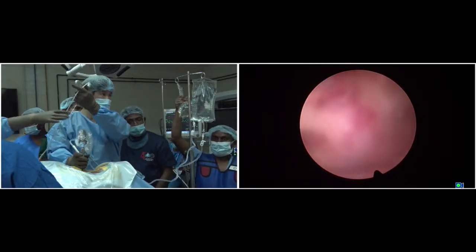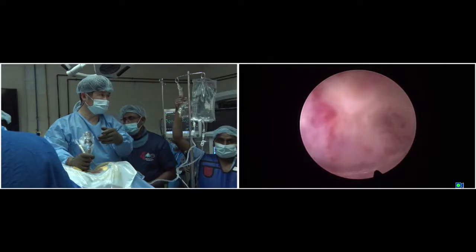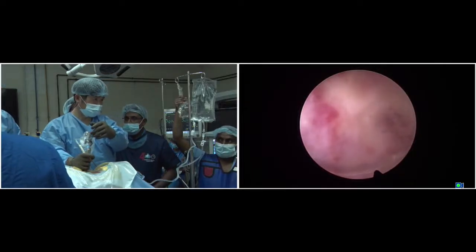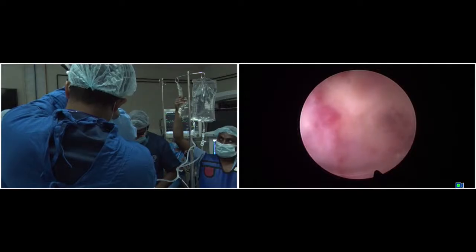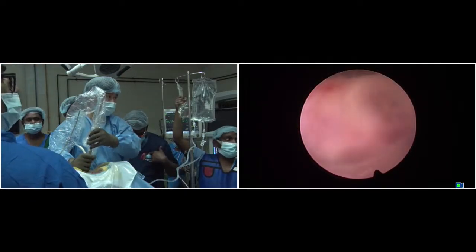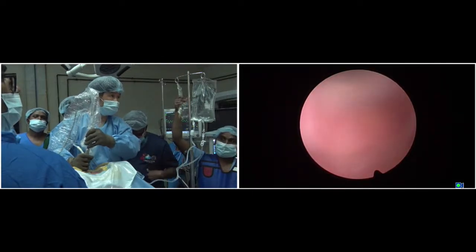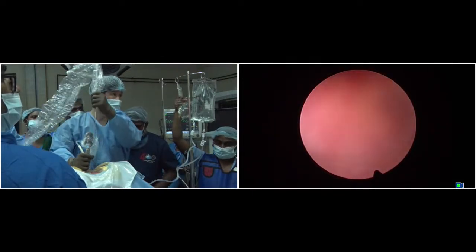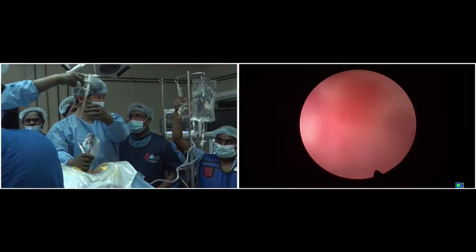Probe. Oh, no, three. Three. Okay, RF. So bleeding.